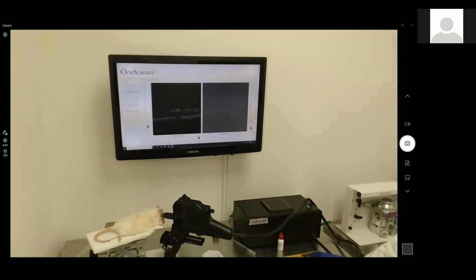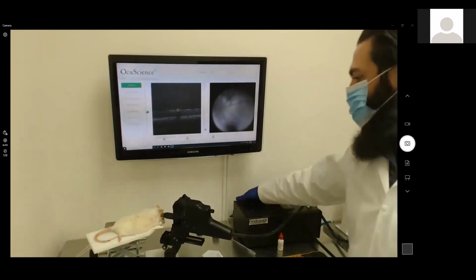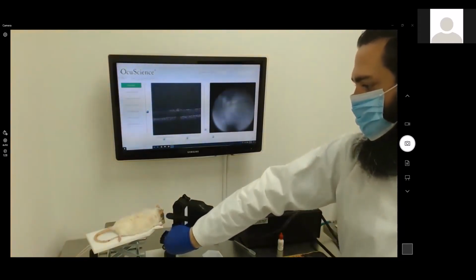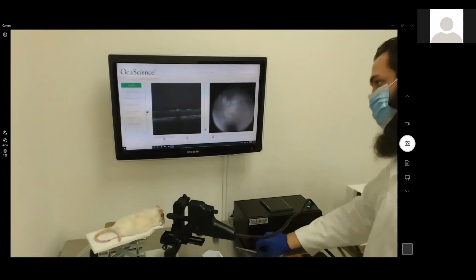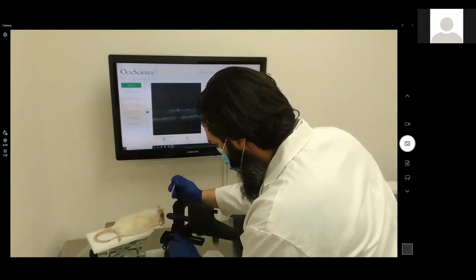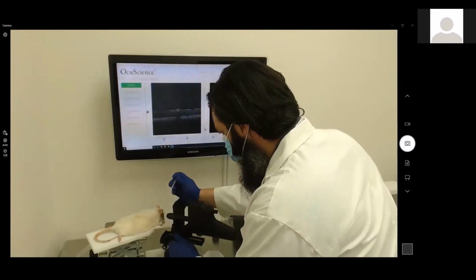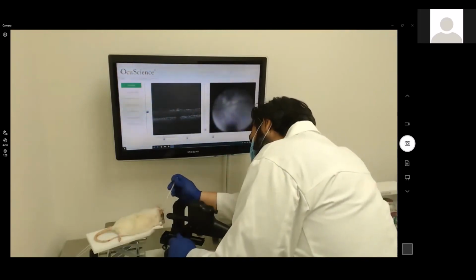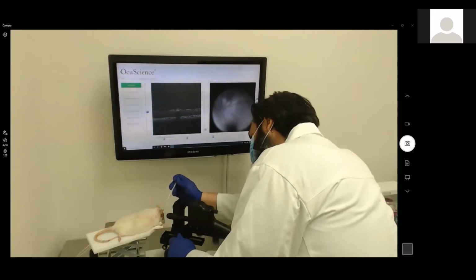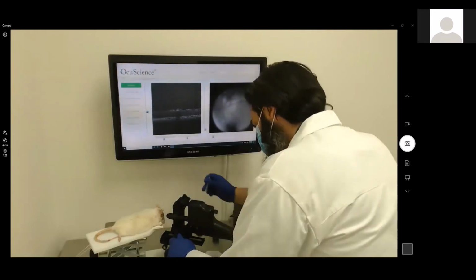What I'd like to go into is kind of show some of our pretty data, and talk about what everyone does to make their data pretty. It doesn't matter what system, you get some raw images, but before you really want to do much with them, you want to add those images together, average them, stack them, denoise them, so that they're easy to analyze and the segments all show up very nice and clear.